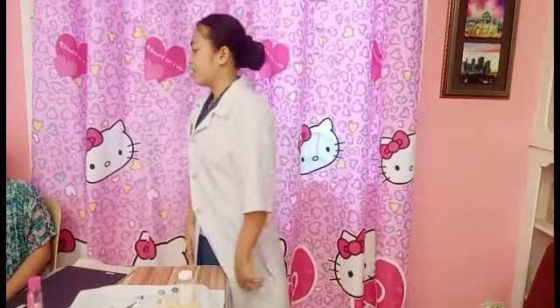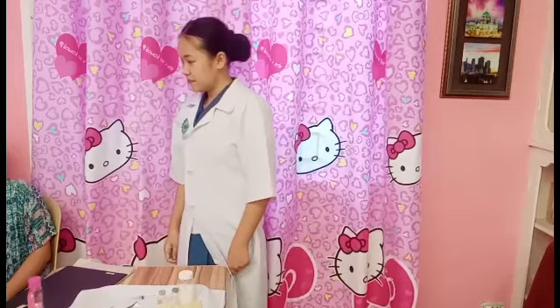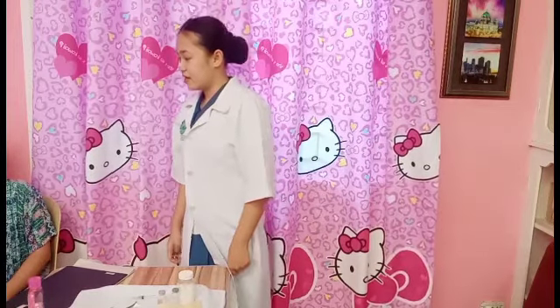Next is to provide privacy to gain trust and cooperation from your patient. And then, prepare the client. Introduce yourself and verify client's identity. So, good morning, ma'am. My name is Perlin Pabroques and I am your student nurse. May I know your name, ma'am? I'm Ariel Gomez. Thank you, ma'am.